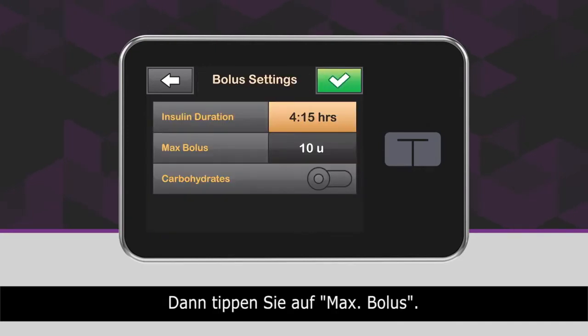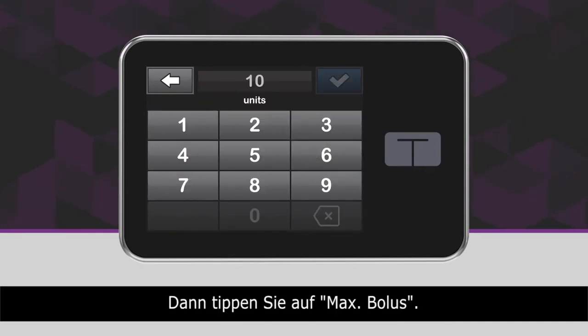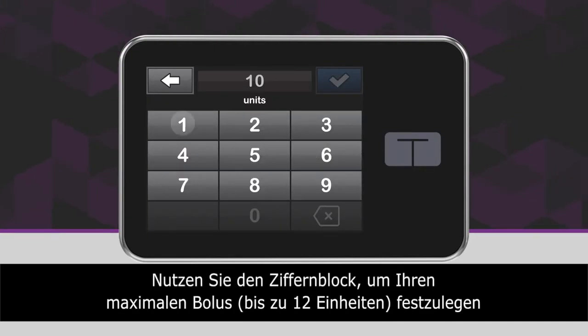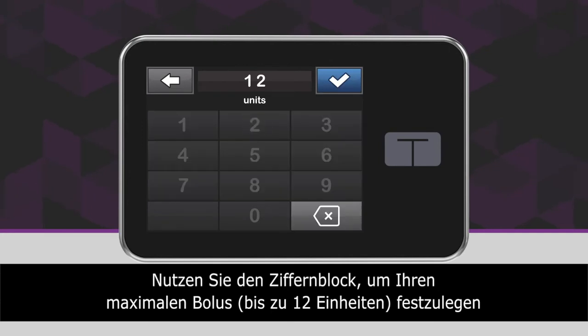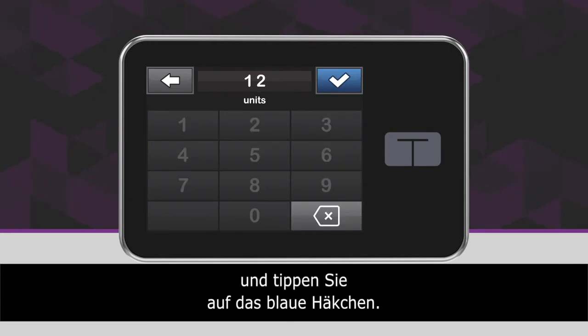Next, tap Max Bolus. Using the on-screen keypad, enter the desired amount for your maximum bolus size up to 12 units and tap the blue checkmark icon.